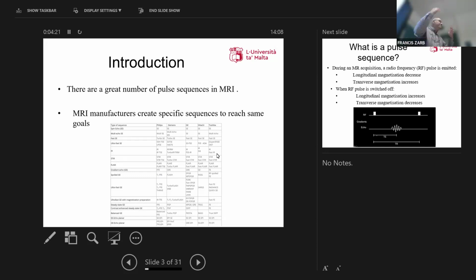Allora, sometimes ħajkun hemm daqsxejn confusion if you are accustomed to working on a Philips unit. The sequences would be one thing. Then if you start working on a GE, you know, to get the same sequence, you need to know what is the name of the Philips sequence on the GE, because you're not going to find the same sequence. Tajjeb, so hemmhekk qatt m'hemmx standardization u harmonization of pulse sequences in MRI between the manufacturers.